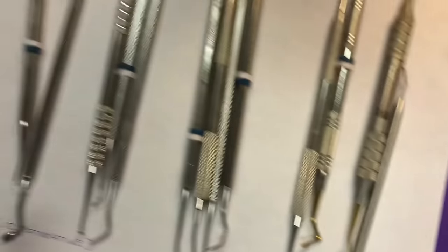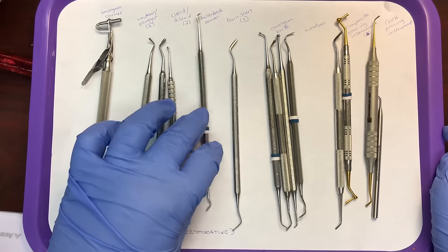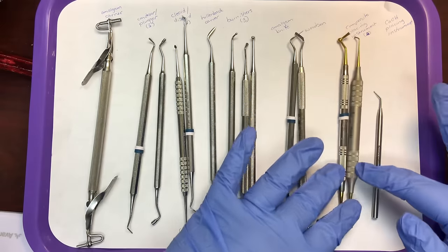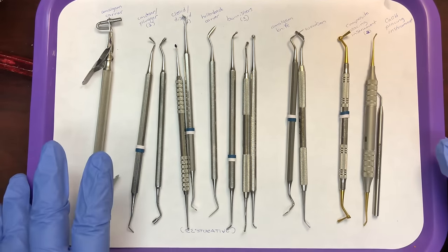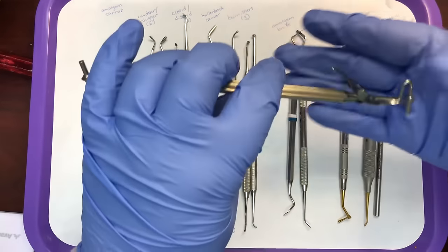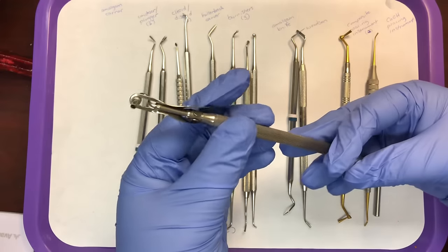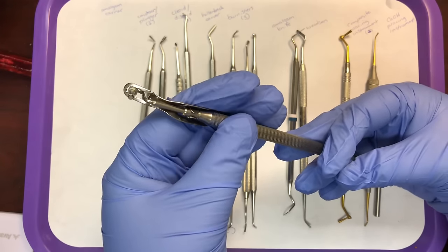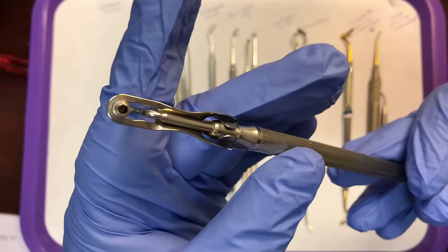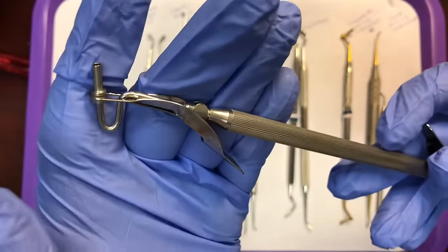There are a wide variety of restorative instruments, but these are very common ones. Restorative instruments act on the restorative material, not the tooth directly. First is the amalgam carrier — it has a unique plunger used to push amalgam out of a hollow cylinder. You pack the cylinder full of amalgam, and when the doctor is ready to deliver it, they push the plunger and a small rod pushes the amalgam out. The amalgam carrier carries amalgam to the prepared tooth.